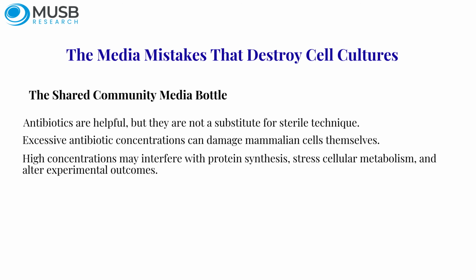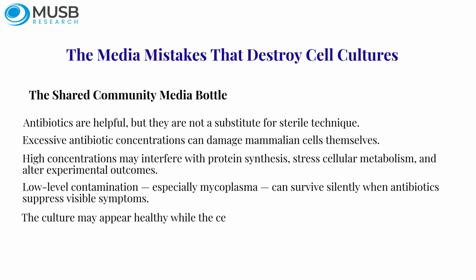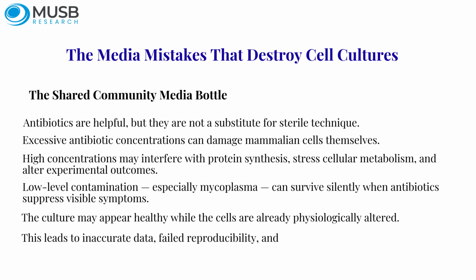But the bigger problem is hidden contamination. Low-level contamination, especially mycoplasma, can survive silently when antibiotics suppress visible symptoms. The culture may appear healthy while the cells are already physiologically altered. This leads to inaccurate data, failed reproducibility, and sometimes entire projects built on compromised biology.